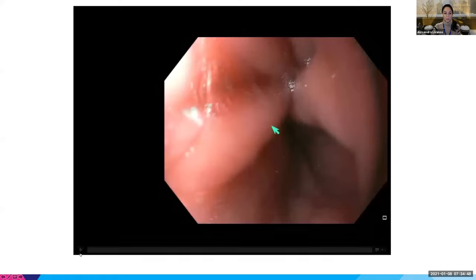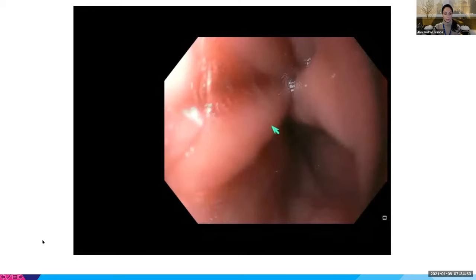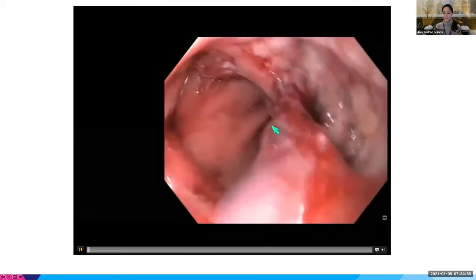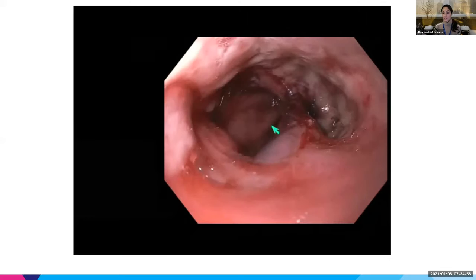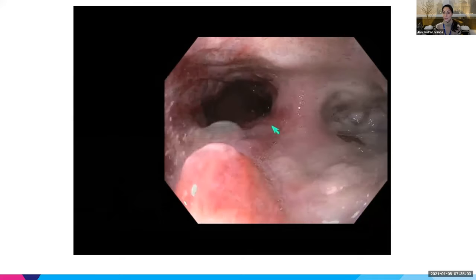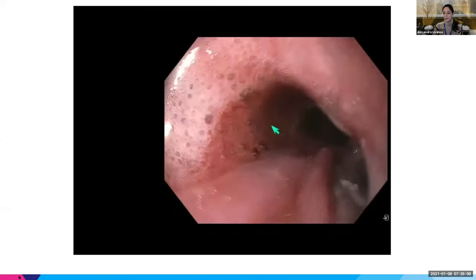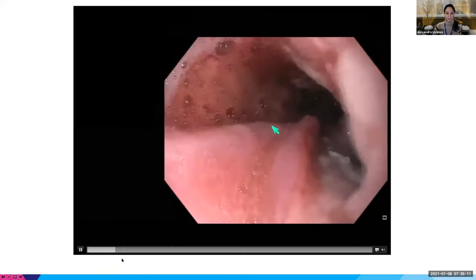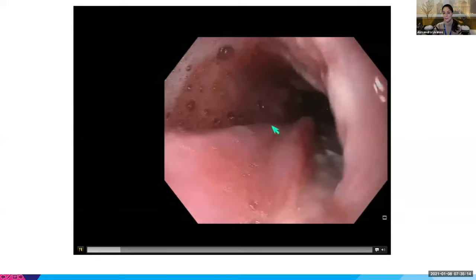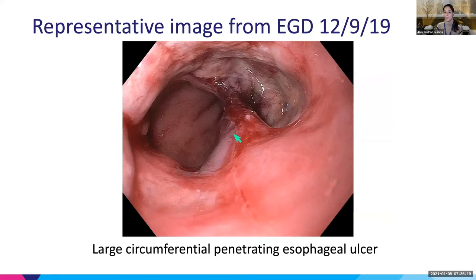This is what we saw — I'm basically at the GE junction and coming back proximally. You can see this really deep cratered ulceration, and then there's more ulceration as we go proximally and it looks pretty awful. Here's a representative image — it's a large circumferential penetrating esophageal ulcer.